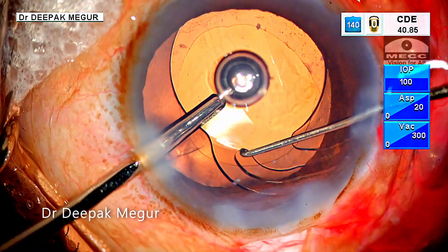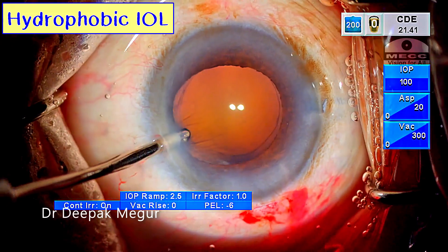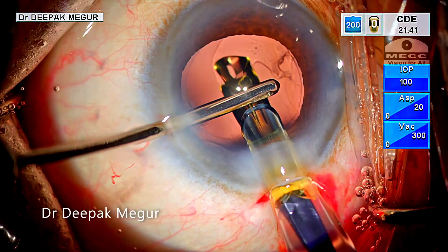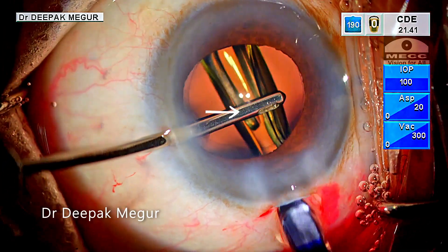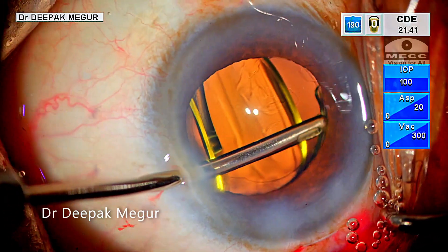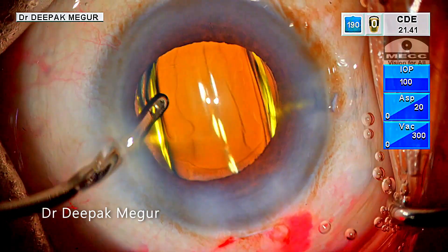The next few cases are of hydrophobic lenses, wherein the principle and technique remain the same. I prefer to use the hydro implantation technique with the push type of injectors. The irrigation cannula is held obliquely above the lens as it is being implanted into the bag. The cannula itself is used to nudge the optic and the haptics into the bag as the lens is being implanted and gently unfolds.